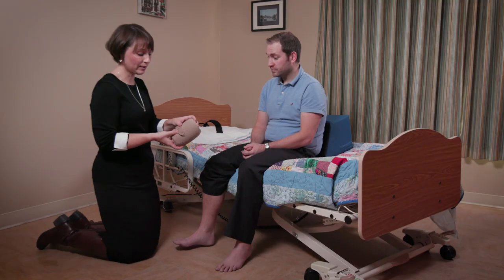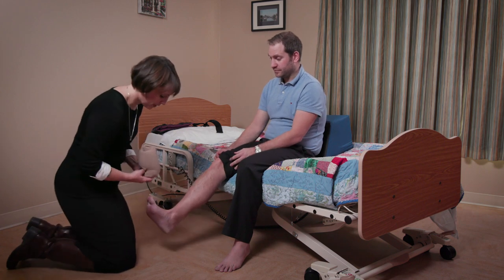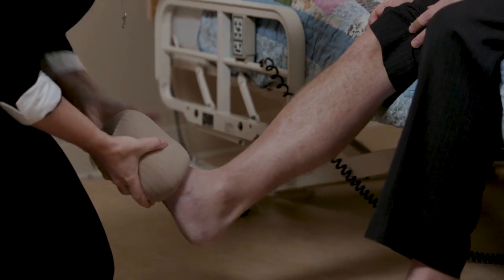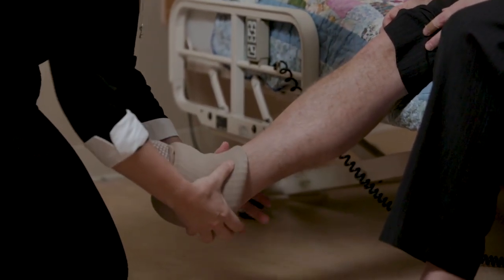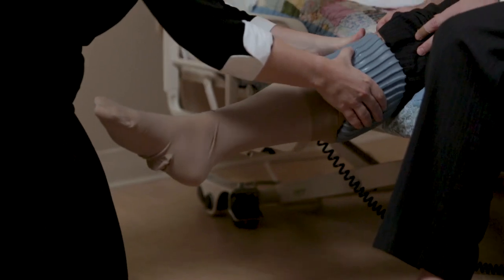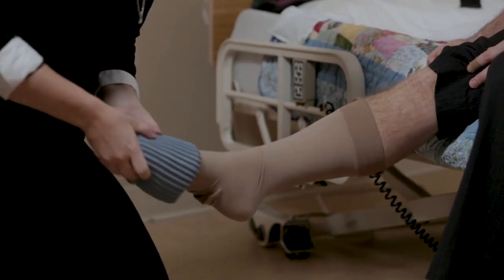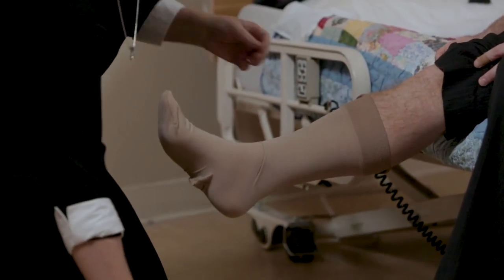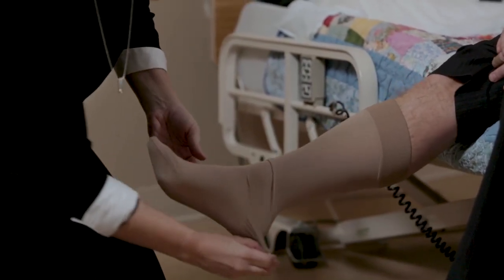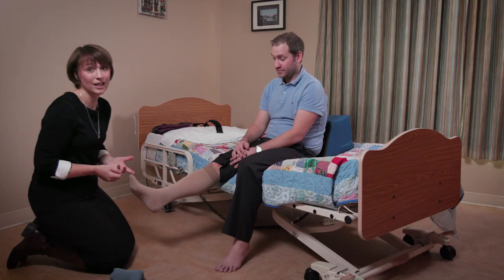With his pant leg up, we're going to position his foot so that the heel is in place, and once the toe is in place, I'm simply rolling through the Dauphin Donner up to the top of his leg and rolling it back off again. You may need to make a couple of small adjustments — pulling up the seam and checking the heel if it's fallen down — then pull up the stocking and the compression stocking is now in place.